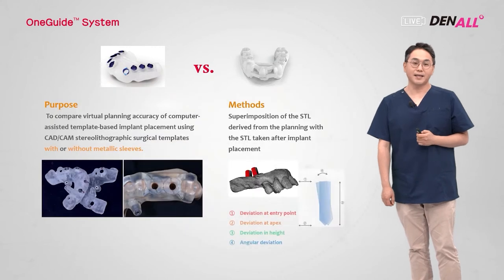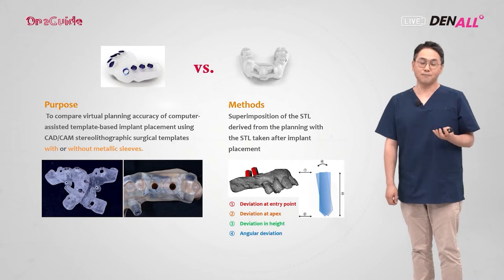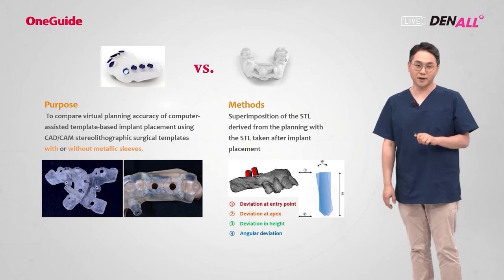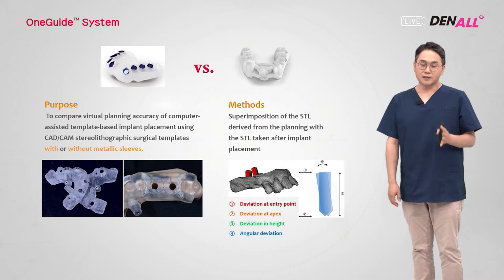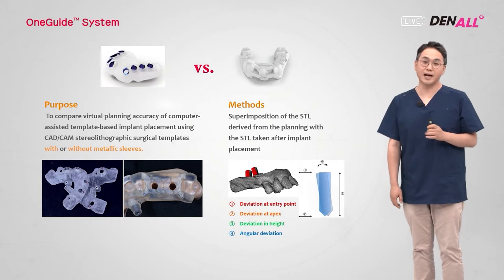If I summarize what we have found, the patients are divided into two groups. In one group, a conventional OneGuide template is used. In the other group, a specially designed OneGuide template to position the metal sleeve is used. Only the OSTEM surgical kit and OSTEM TS implants are used. So in one group, OSTEM implants are placed using the OneGuide template with a metal sleeve. And in group two, the OneGuide template without the sleeve on the market is used to place the TS implants. Pre-op planning data and the post-op CT data are superimposed to see the angular deviation and the three-dimensional implant positioning deviations using four parameters.